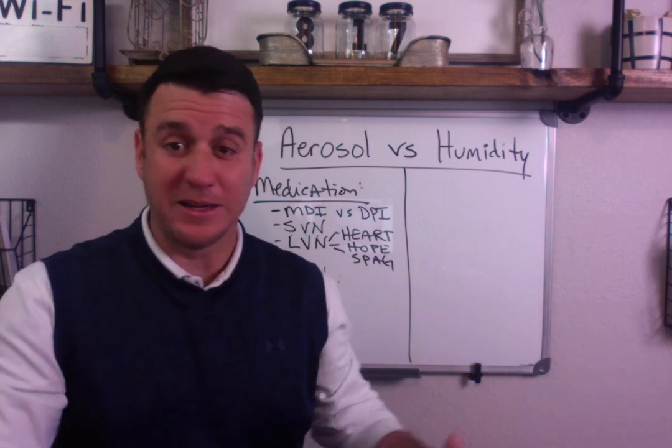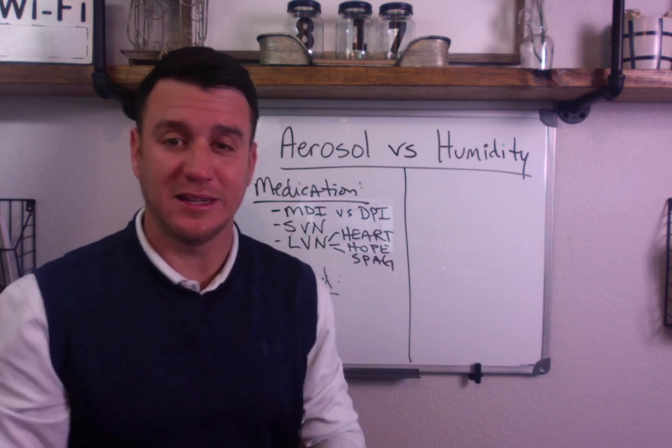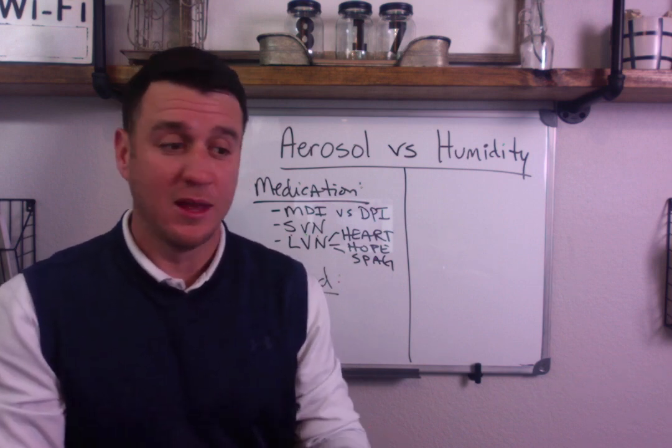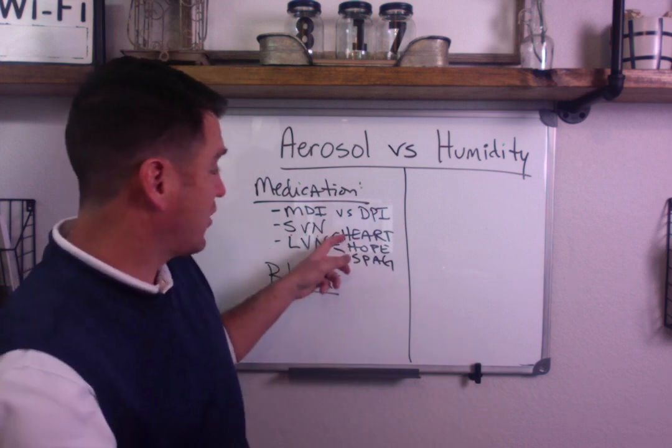Now, you don't really typically see that anymore, okay? So for us in the ERs that we're working in today, if you need to give a continuous medication greater than 1 or 2 treatments, you're probably going to use either the HEART or the HOPE.